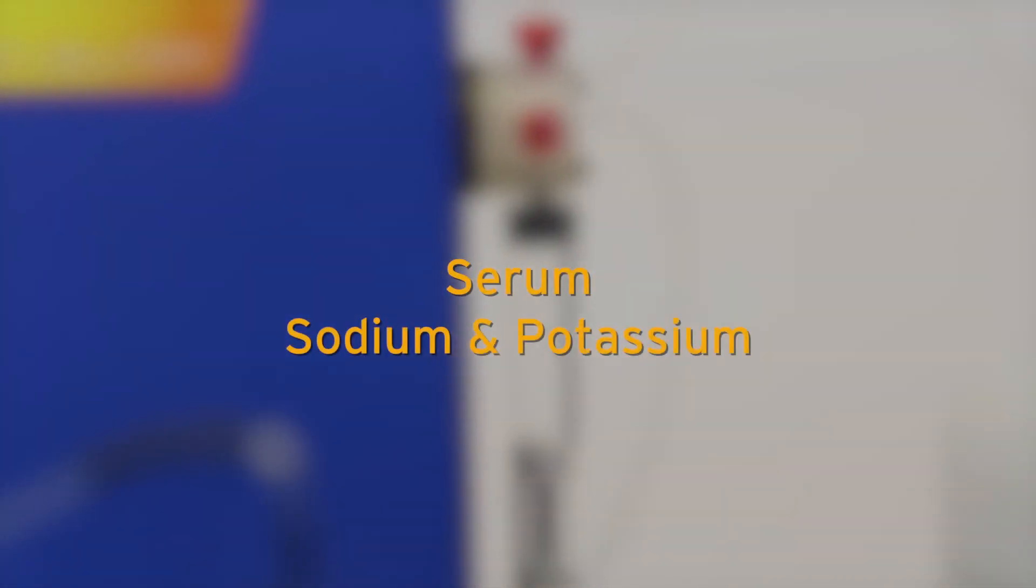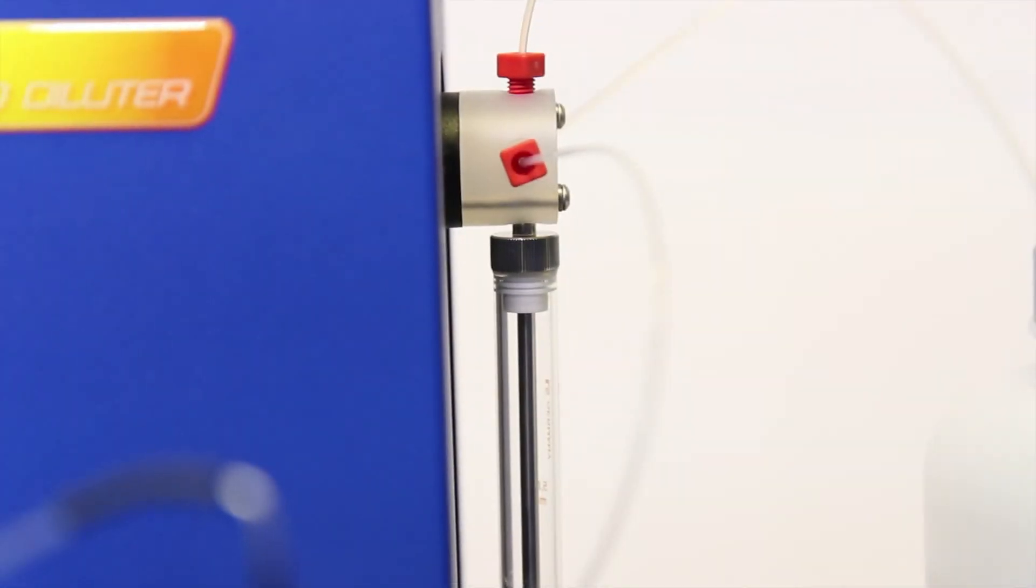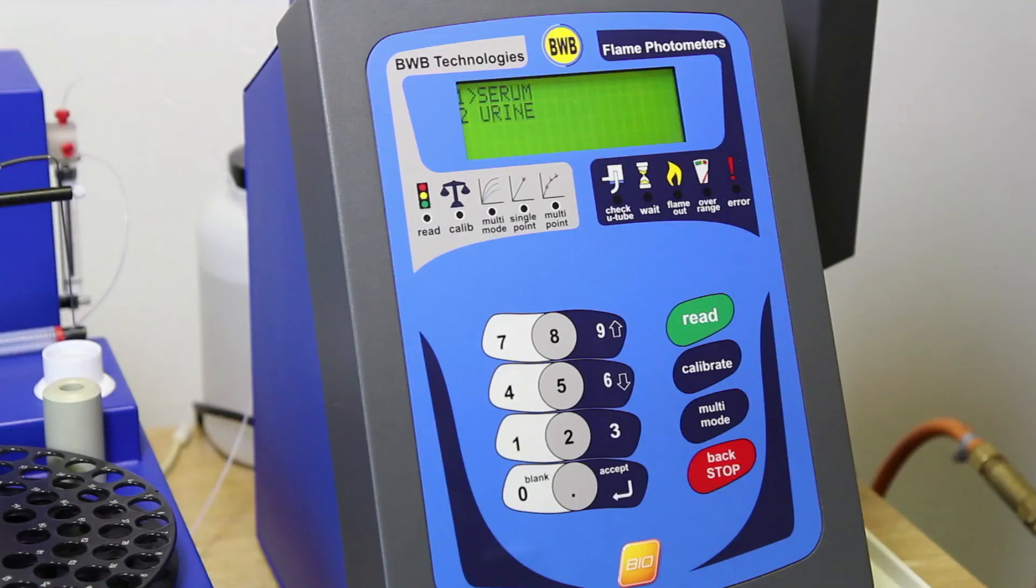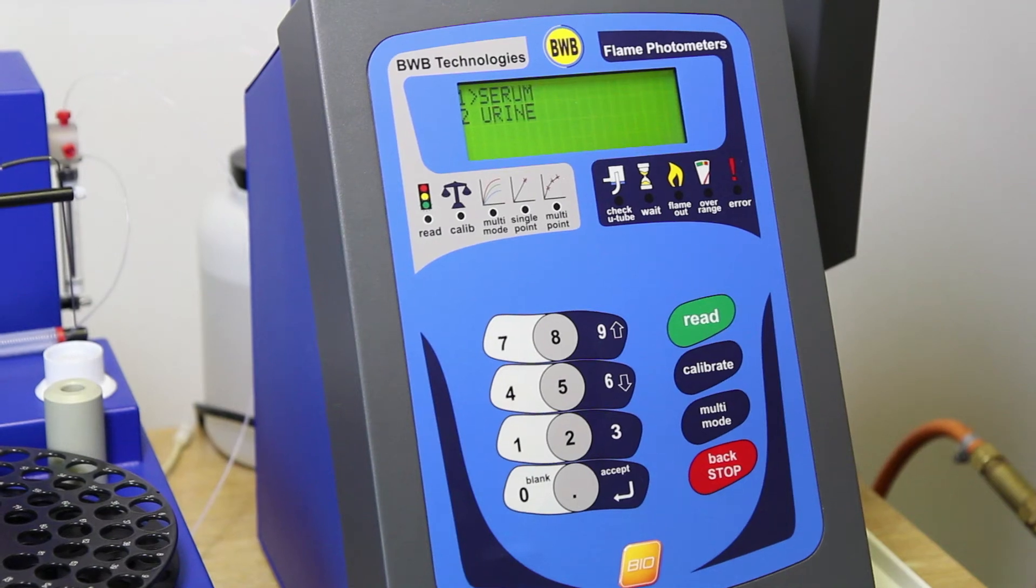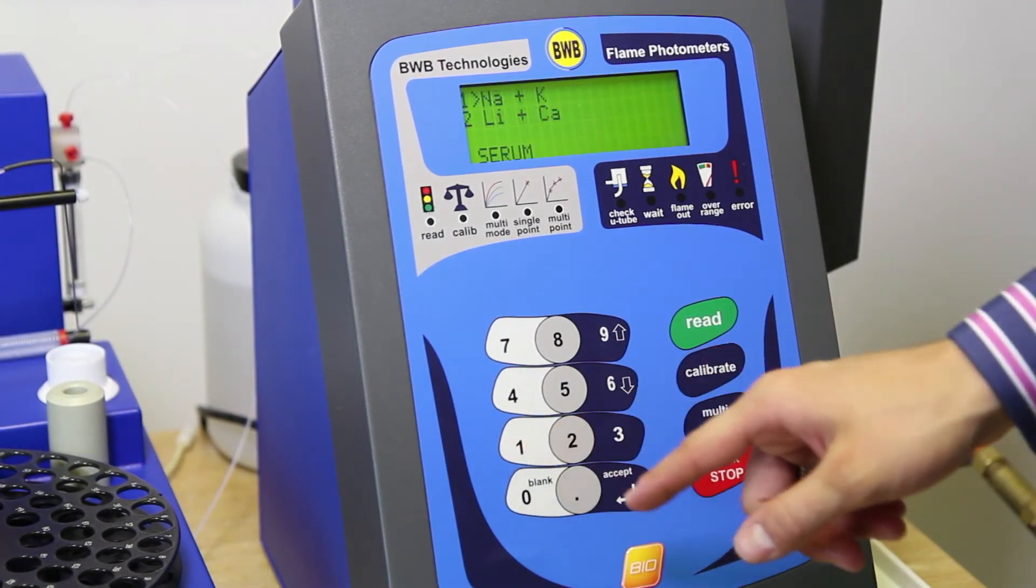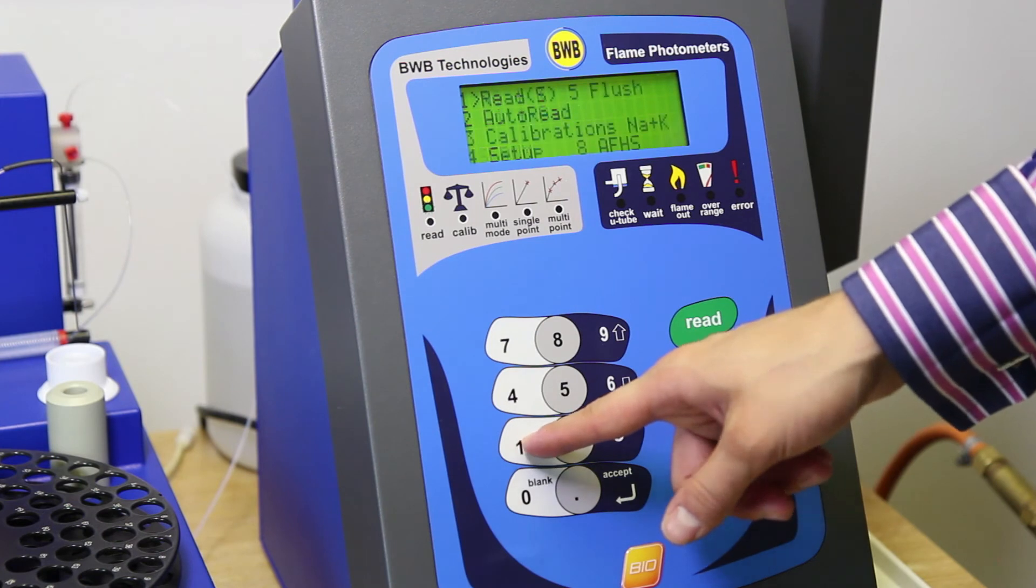For the purposes of this tutorial, we will be calibrating for serum with sodium and potassium as the ions of interest. From the BWB Bio main menu, select Serum and press Accept. Now select Sodium Potassium.